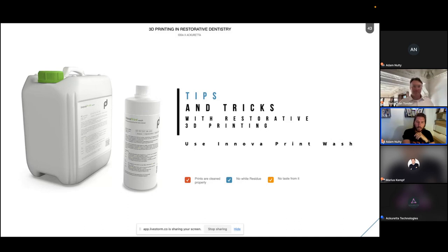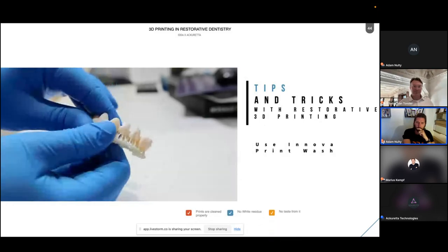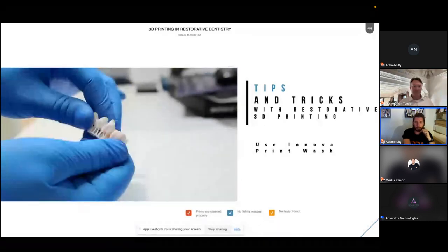Now, something else with tips and tricks involving the print wash, in terms of brushing it. Q?